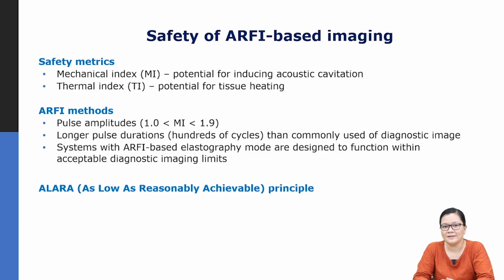But keep in mind that sonographers always make sure that they follow the ALARA principle. ALARA meaning as low as reasonably achievable.